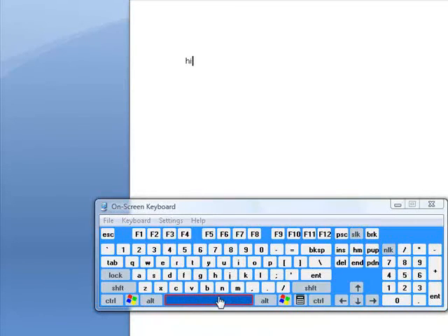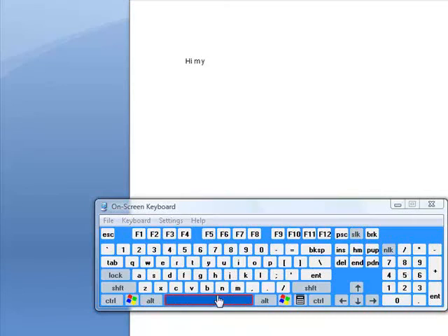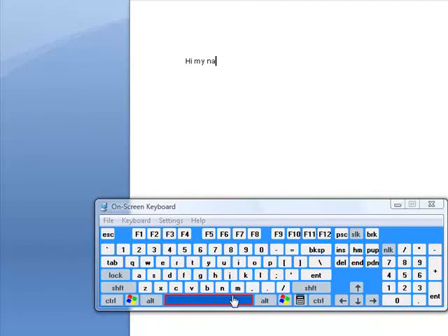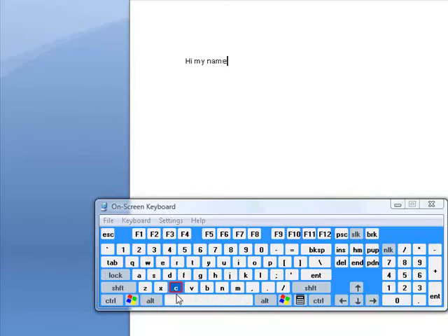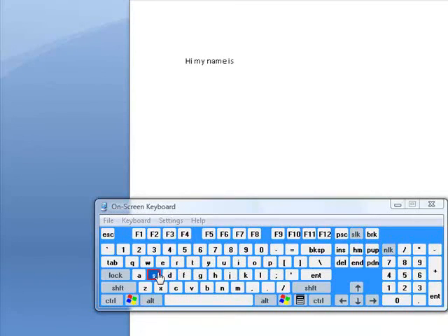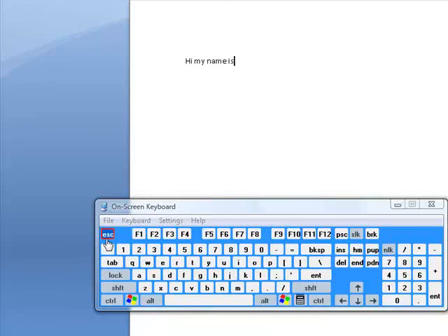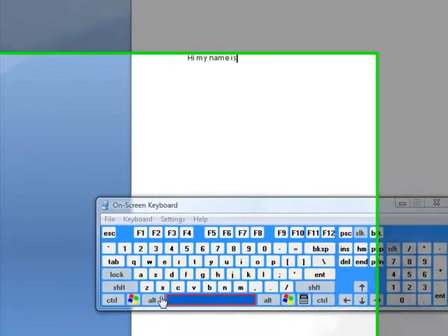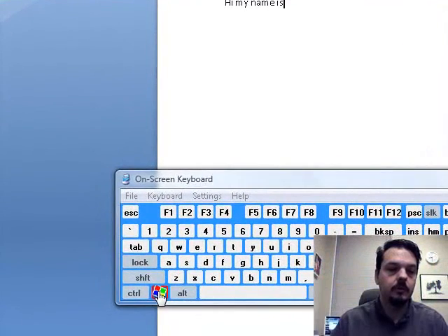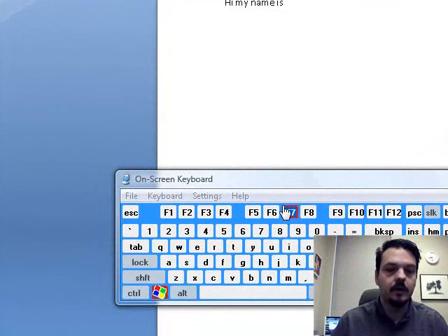I can use my adaptive pointing device in this on-screen keyboard. So I can say, hi, my name is, and you can go on and on and type all kinds of things. And you'll see that this keyboard has the function keys, the escape keys, all the different keys that you would need to control your computer, including the Windows key and those kind of things.